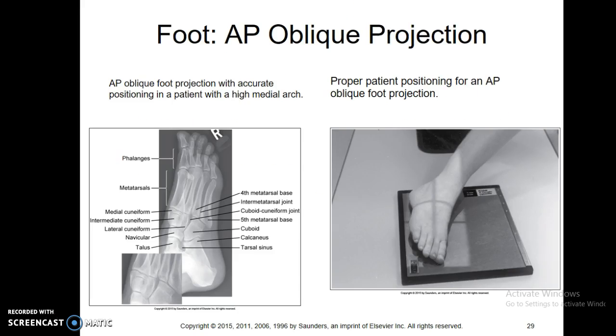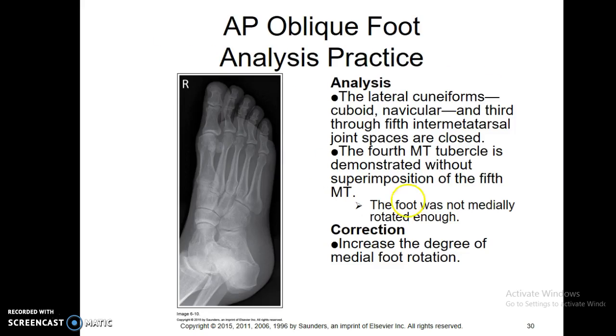Medial oblique foot, so make sure you don't oblique them too much. Just should be a true 45-degree rotation on this. Generally, you want to kick the heel out a little bit when you do this. So if they're doing it on the table, when you rotate the foot or the knee towards the medial aspect, what you want to do is kick this heel out just a little bit, just to get a nice straight line going all the way down here, so that we don't have a problem getting the talus on at the very, I would say, proximal portion of the foot.